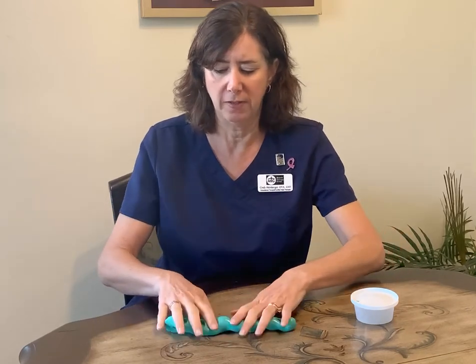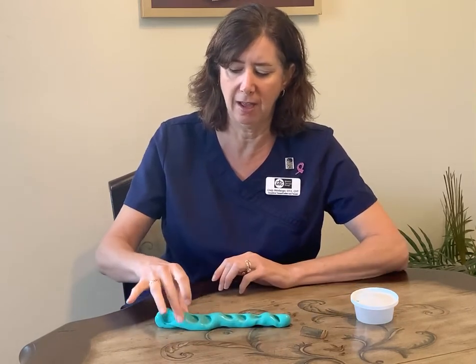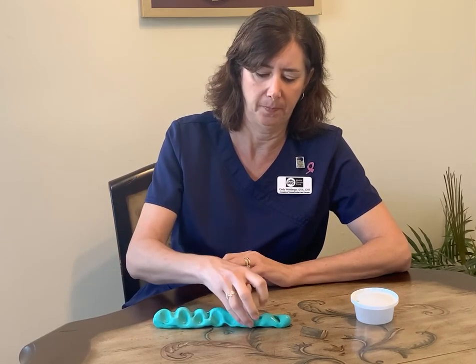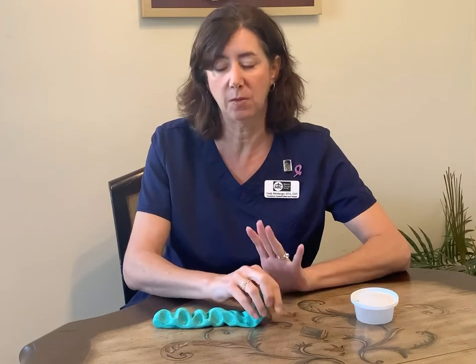Then you can just sort of tip your putty onto the side and you'll have another log that you can pinch down the edge. So that's the second one.